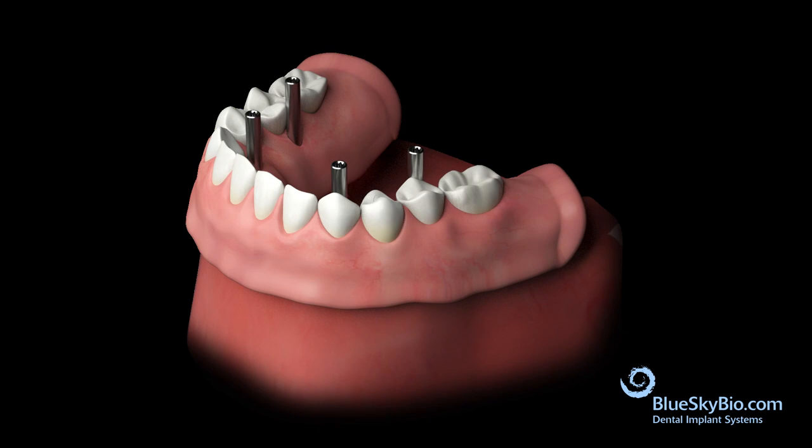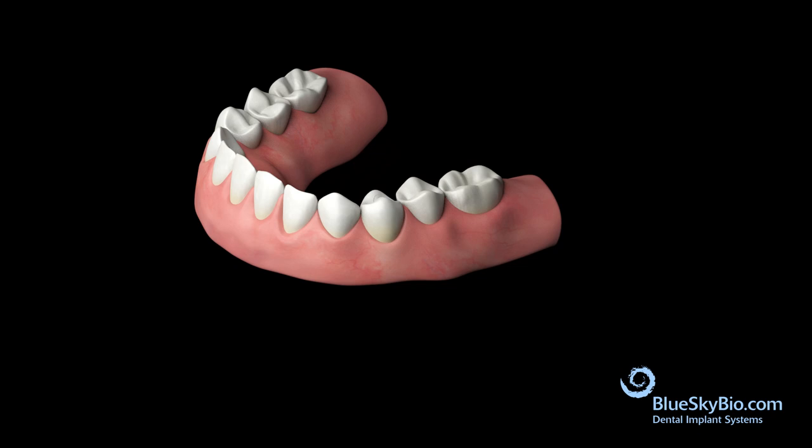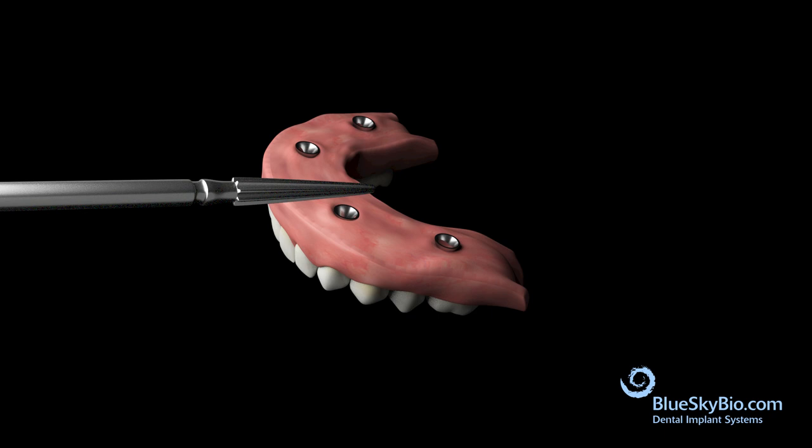Cut off the flanges and polish the denture. Shave the underside of the denture to ensure it is convex and cleansable. The Trilor bar is completely encased.